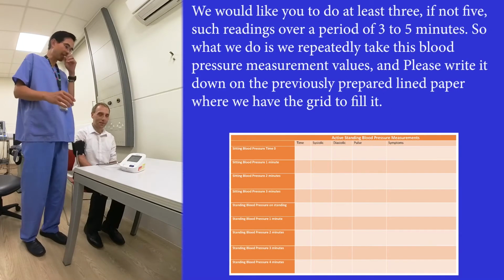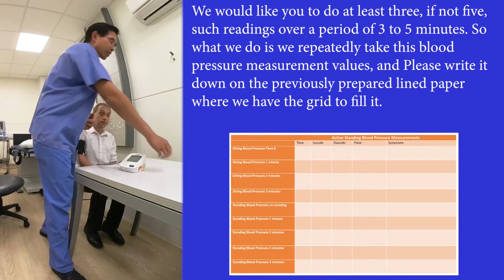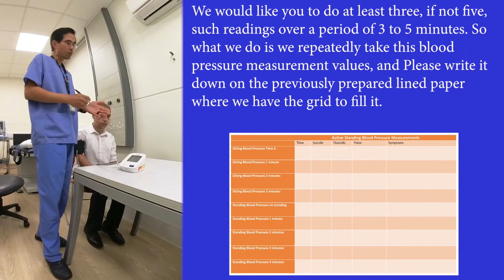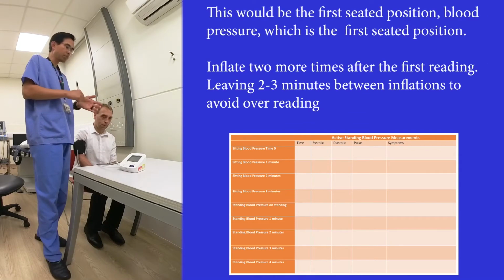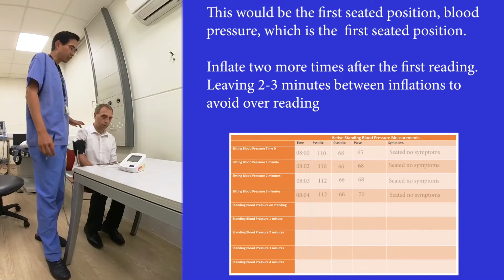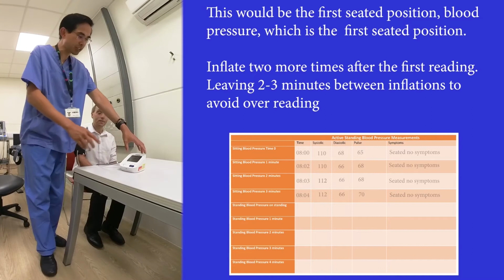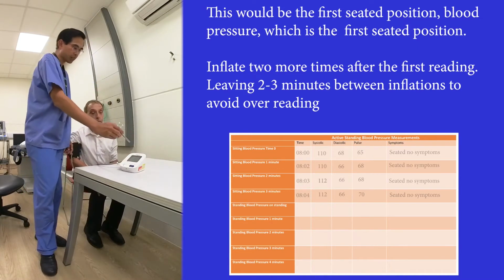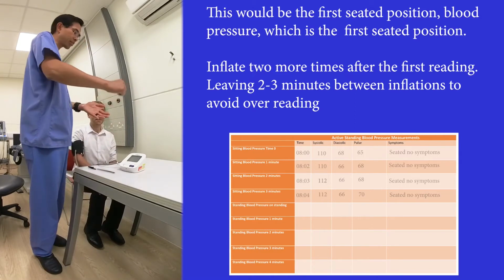We would like you to do at least 3, if not 5 such readings over a period of 3 to 5 minutes. So we repeatedly take these blood pressure measurements and write them down on the previously prepared lined paper where we have the grid to fill in. This would be the first seated position blood pressure, BP1 seated position. We'll ask Phil how he feels, and you realize that Phil is not really speaking or doing very much. The first blood pressure we can see there, we'll record it: the systolic, the diastolic, and the pulse rate. And right now we'll just write in the comment section, seated.